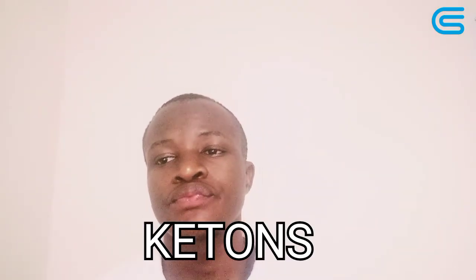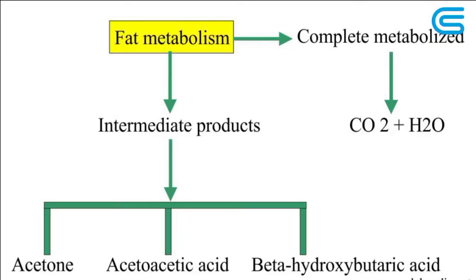So there is also a component in the urine strip that we refer to as ketones. Excretion of ketones occurs when there is a breakdown of products of fatty acids, and it indicates excessive fatty acid metabolism to produce energy.